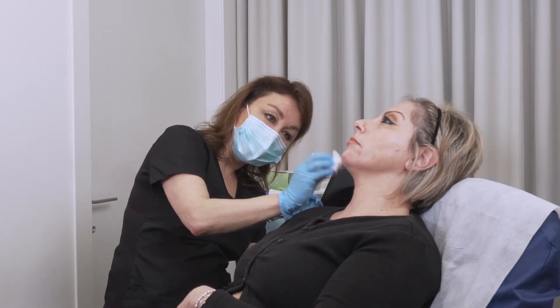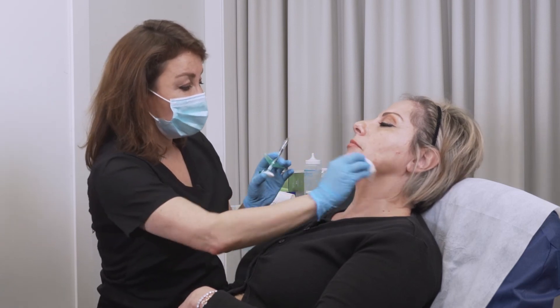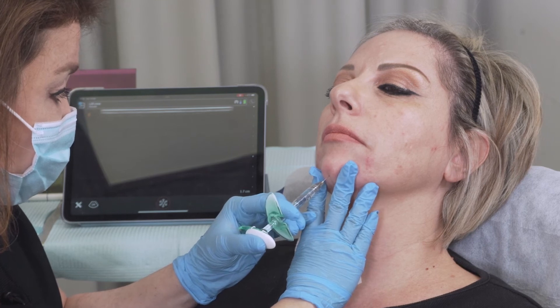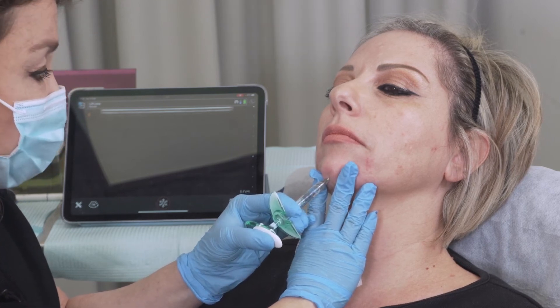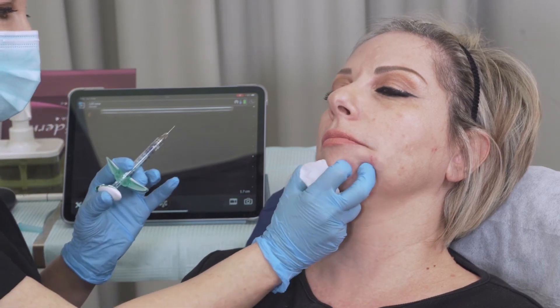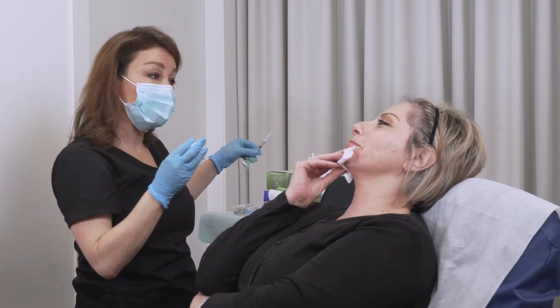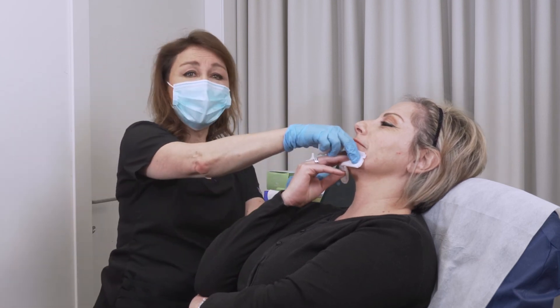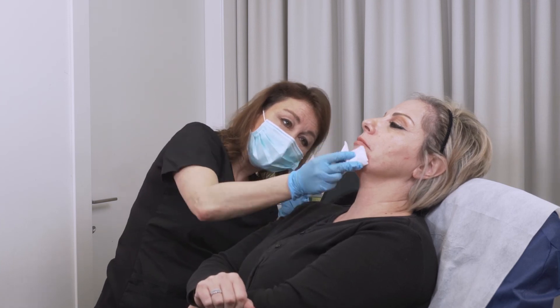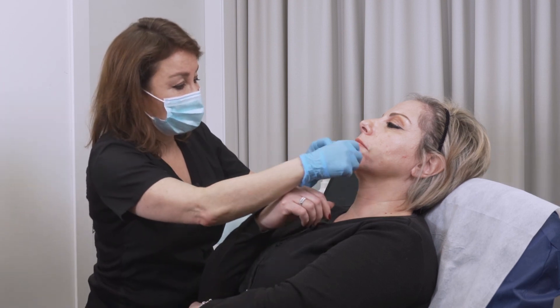We already got some projection here, but I will need a little more. I'm quite deep towards the bone to get the right projection of her chin. As you can see, there is quite a nice projection, and I may need to make a few more corrections, but the area and the line of projection is very nice.